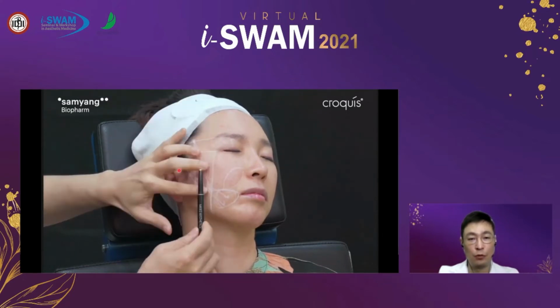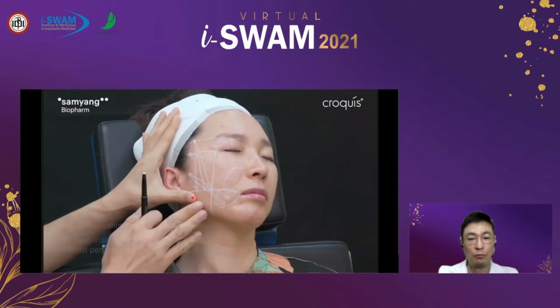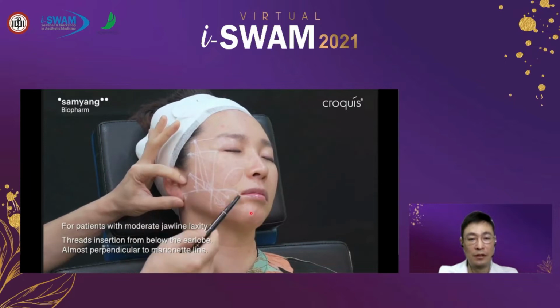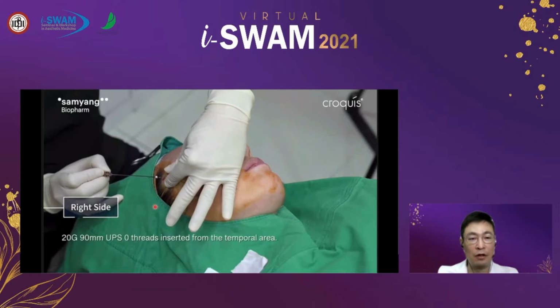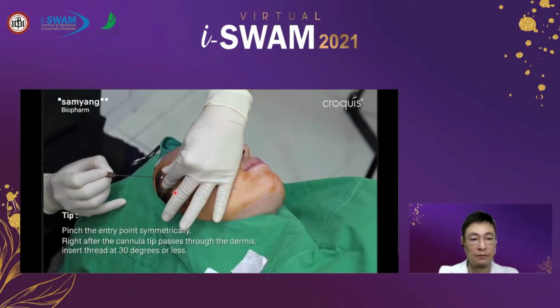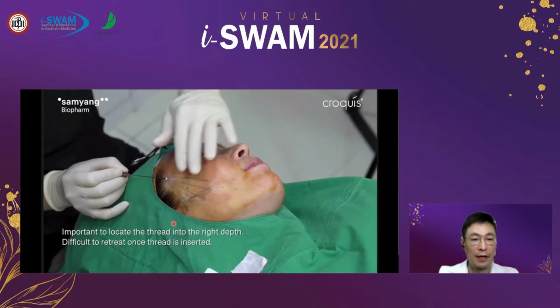And one more entry point, just in front of the tragus, for jowl lifting. You can put more threads in a horizontal direction if the patient has a jawline distortion or a too definite, obvious Marionette line. But for younger patients, you only need to make two entry points. That's enough. And before inserting the thread, pinch the skin symmetrically. It's very important.